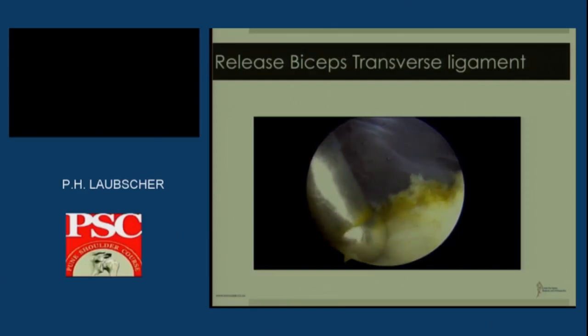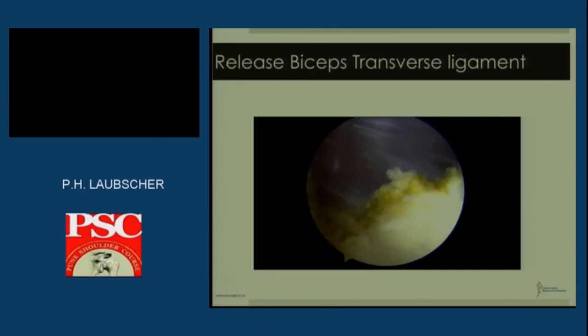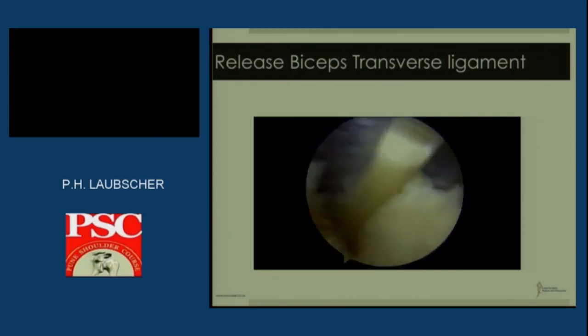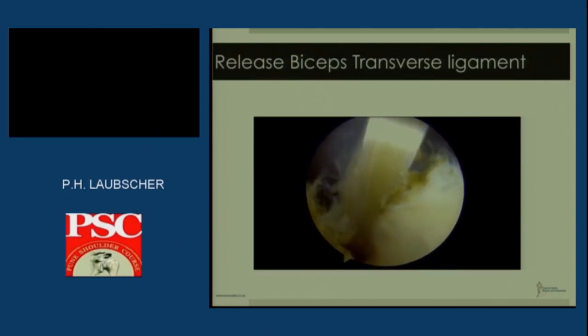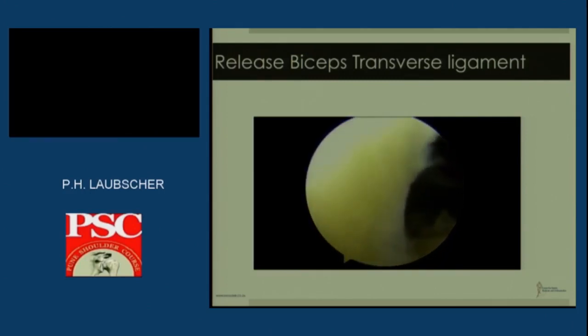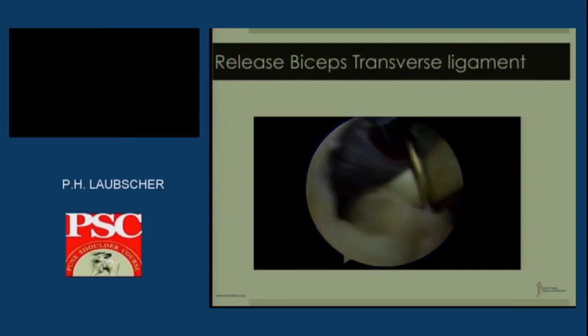We are looking down the groove of a biceps. I have my ablation device in an additional portal, and I'm releasing the full length of a transverse ligament. You can see you can sublux the tendon out of a groove. The reason why I want to do this is some of the studies from America have shown that if you leave a transverse ligament, this can be a source of pain. And of late I've been deciding to release my transverse ligament.